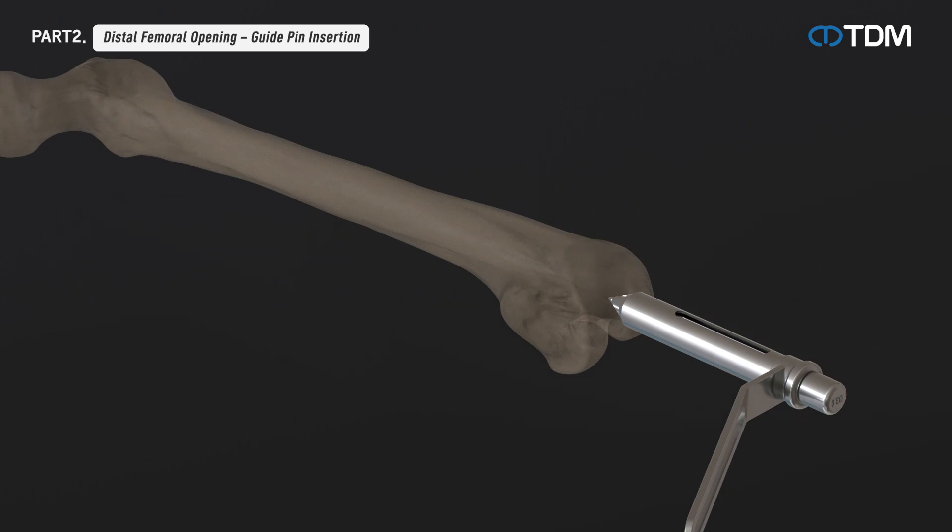Remove the trocar and insert the guide pin combined with the electric drill or guide pin holder into the appropriate location. Remove the drill sleeve and insert the open reamer along the guide pin to drill until the head of the reamer reaches the proper position, then remove the open reamer and guide pin in turn.